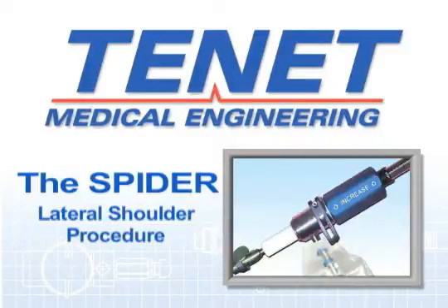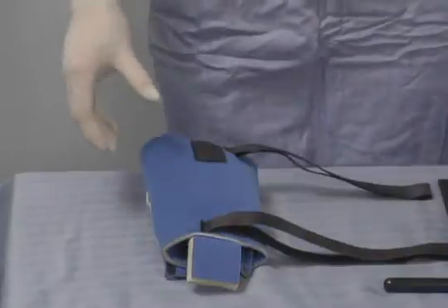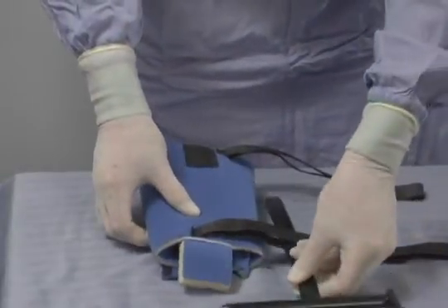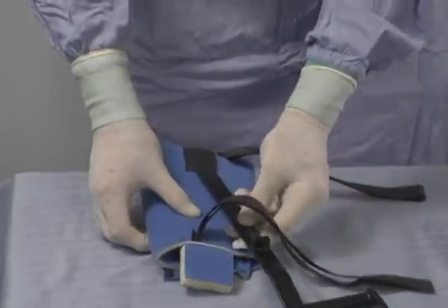The traction accessory attaches into the piggyback, and the lateral shoulder connection bar inserts into the traction accessory. Prepare the lateral shoulder connection bar with the components from the shoulder stabilisation kits — this is the same kit used in the beach chair cases.